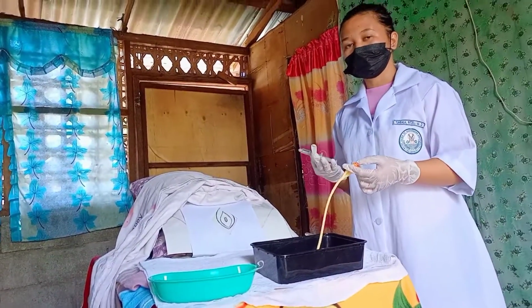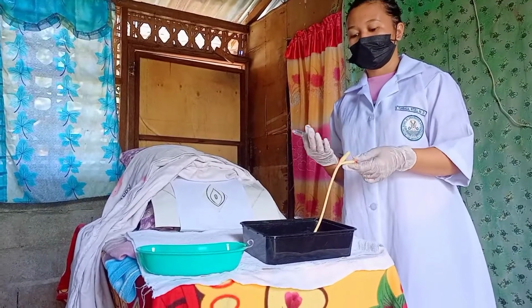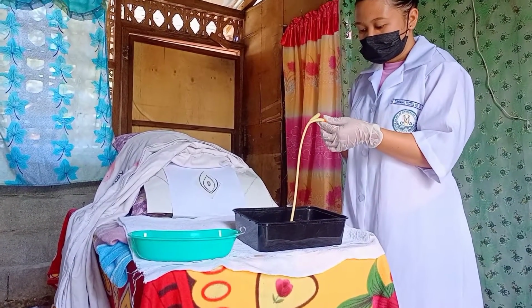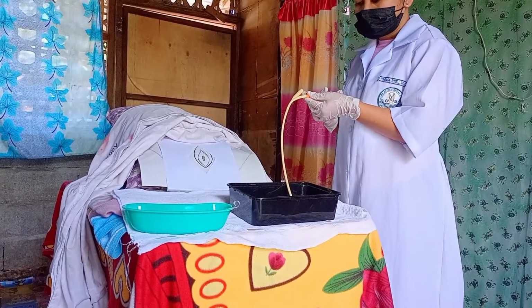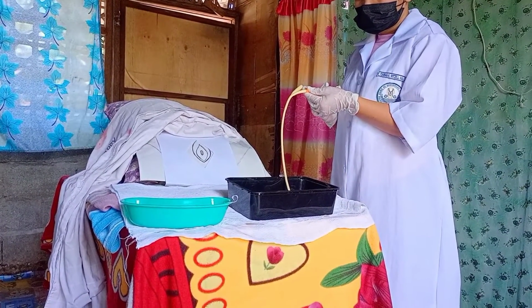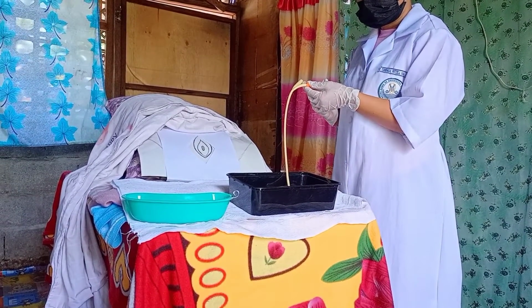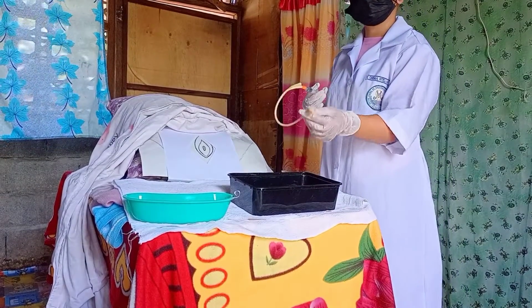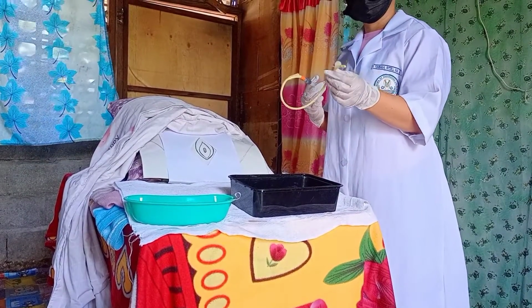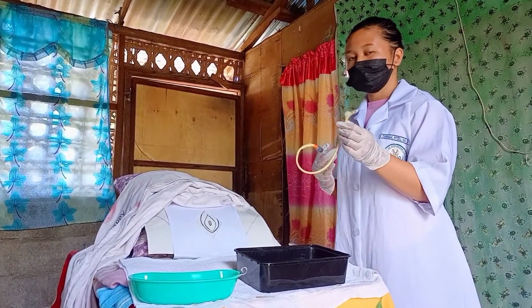So now I want to test the balloon. If the balloon malfunctions, it is important to replace it. To test the balloon, I don't see any malfunctions of the balloon.